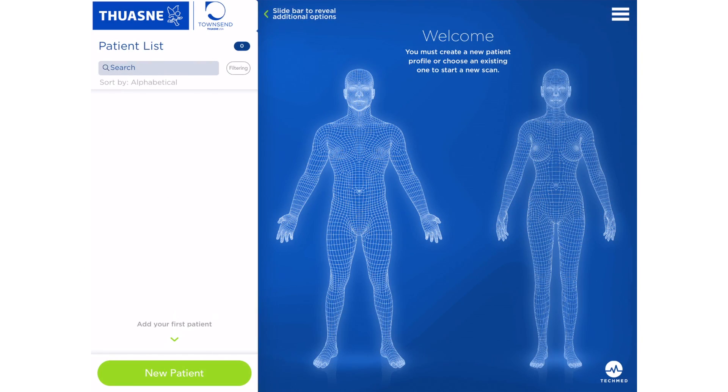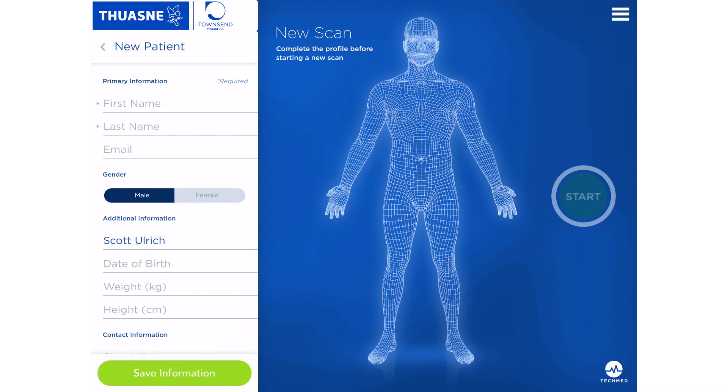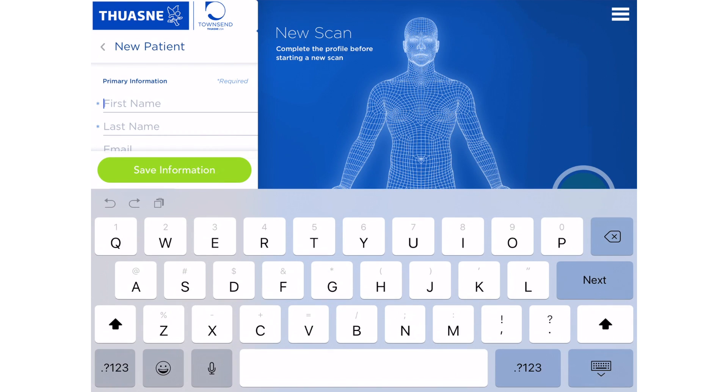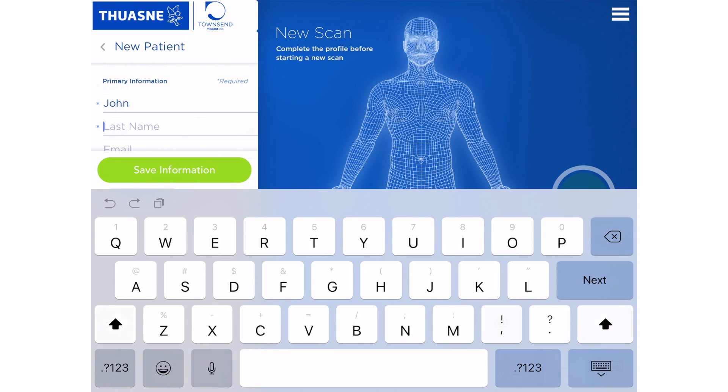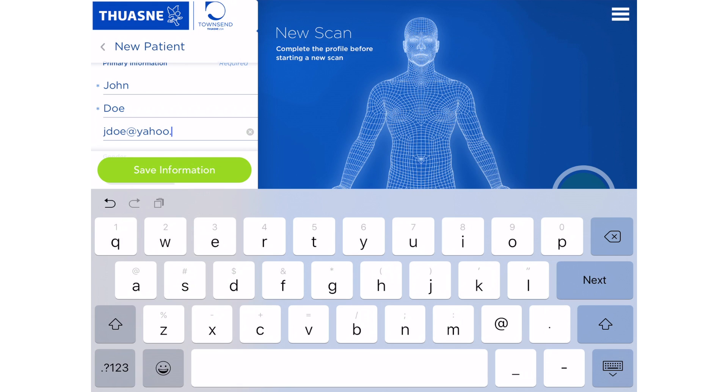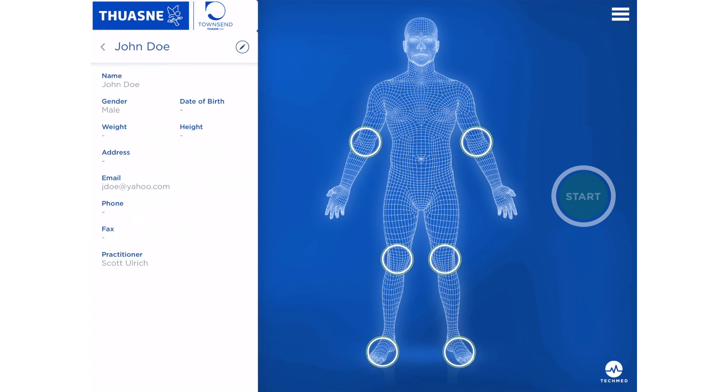Start by adding a new patient. This will prompt you to input the required fields and specs of the patient, such as weight, height, age, and so on. Once you have set your field requirements, press the Save Information button and all the patient information will be saved to your scanning library.